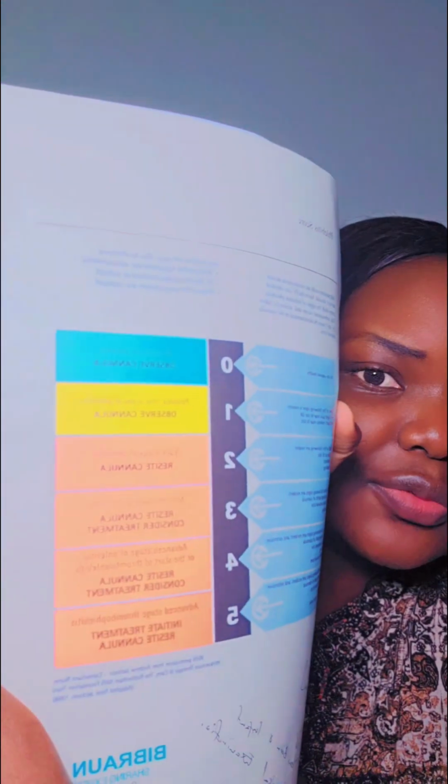Should I go through the phlebitis score? Let me go through it briefly. For someone who may not be able to access it, I think I need to just give it to you. Let me just read it for you from 0 to 5. So if you're watching this video, you have everything in mind. The VIP score is from 0 to 5.